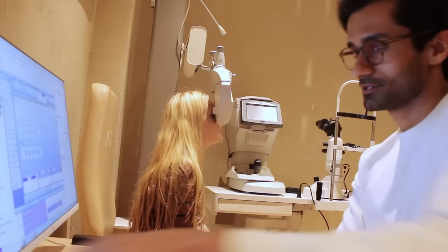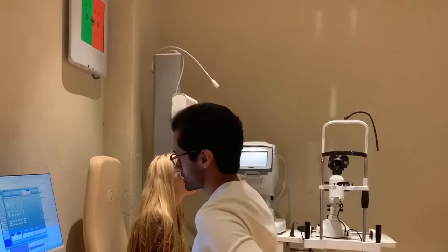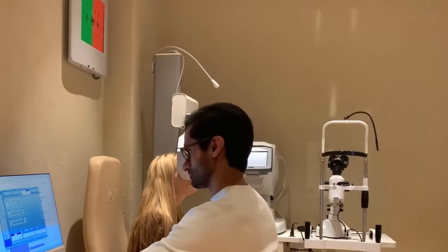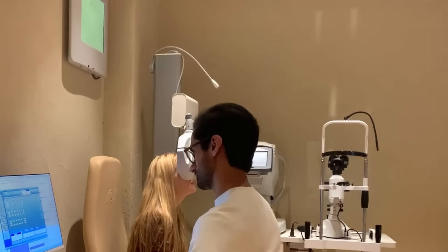Okay. So just onto the red and green. Numbers better, red, green, same? Red's a bit bolder, I think. Okay. No? That's the same, yeah. Perfect. Try the top line. It's quite small. D, N, Z, L.